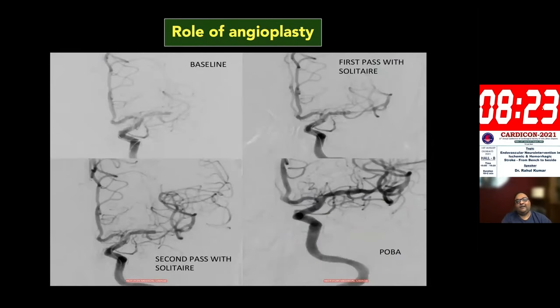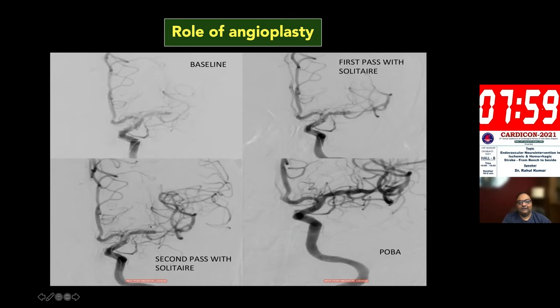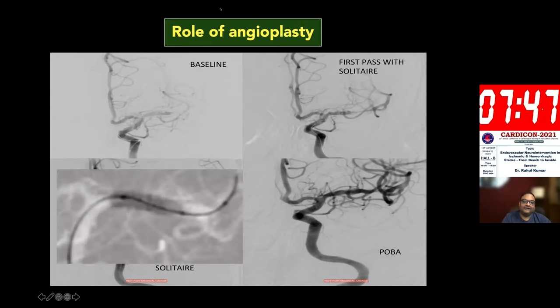Sometimes thrombectomy or thromboaspiration alone does not help. A patient with left MCA occlusion was treated with three passes of the solitaire stent retriever device, but each time the vessel would open and then reocclude. Angiography revealed intracranial atherosclerotic disease (ICAD) not letting the vessel stay open. In such situations, a stent retriever or aspiration will not work alone, so we proceeded with balloon angioplasty. After a simple plain balloon angioplasty, the vessel stayed open and the patient did well.